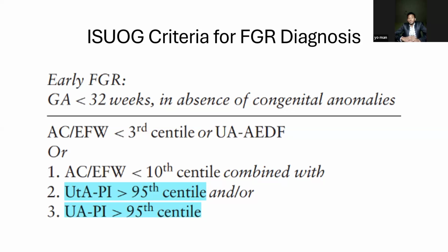And these two are my last slides. So I'm going to walk you through the final diagnosis of FGR based on the ISUOG criteria for FGR diagnosis.